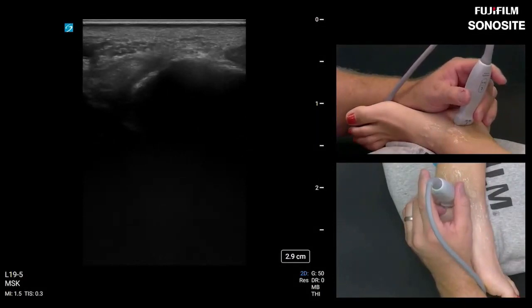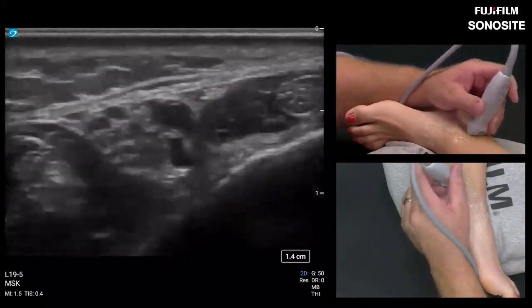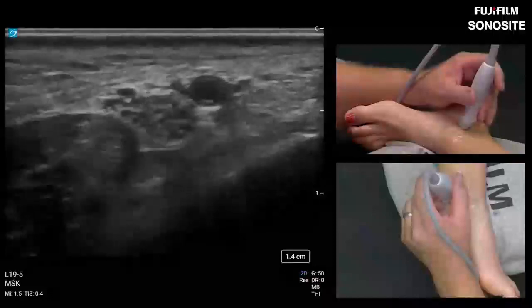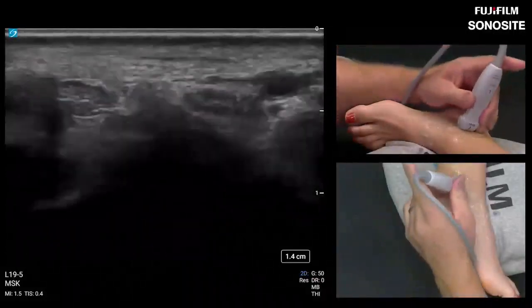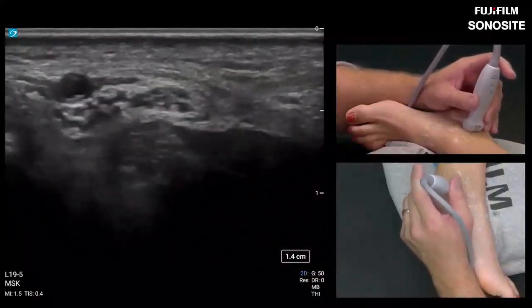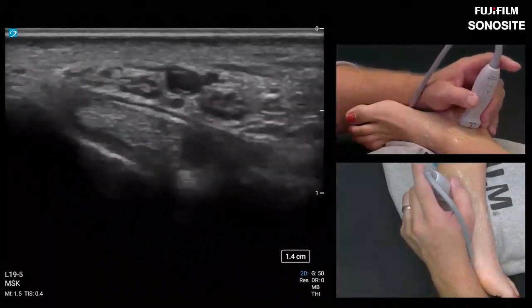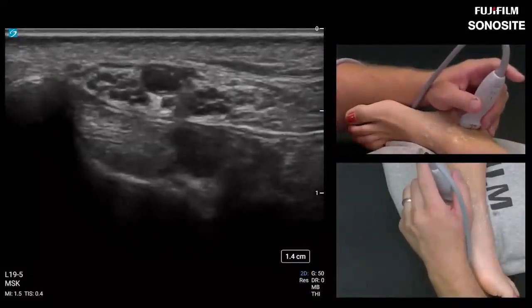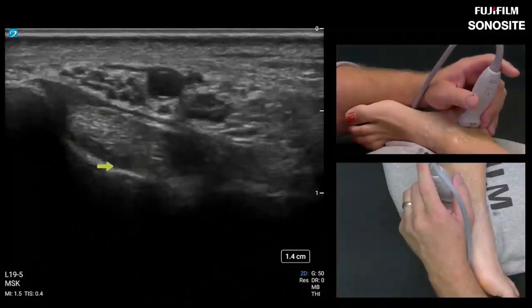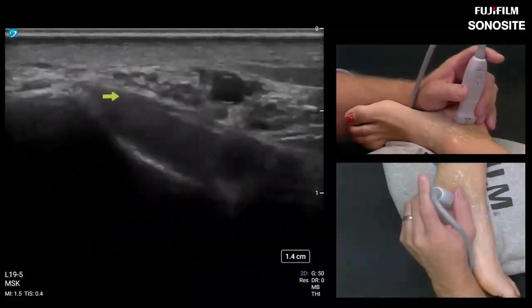I'm going to bring my depth up more shallow. And now let's follow these fascicles and see if there's anything inside the nerves that we notice could be contributing to any issues. So I look for nerve swelling, I look for space occupying masses, calcium deposits, old bony fragments in the tarsal tunnel, but especially here at the FHL level, where the sustentaculum tali, the calcaneus is with the FHL, this little tunnel here is where we see a big effusion will collect and push into the nerves at this level of the tarsal tunnel.